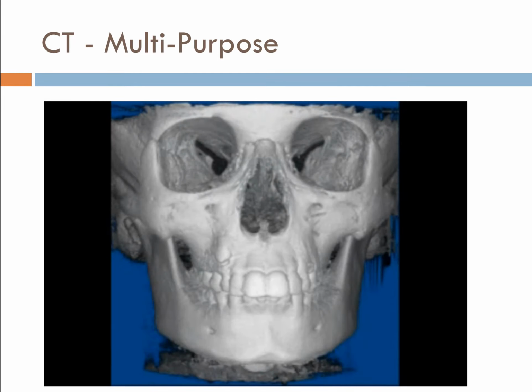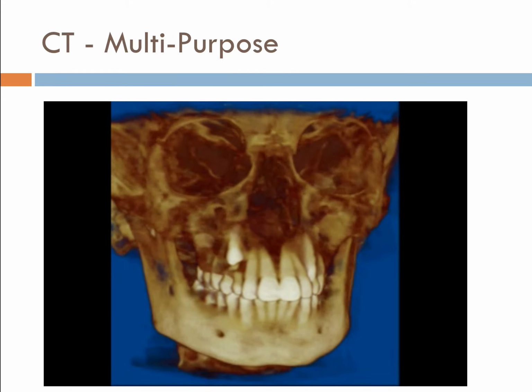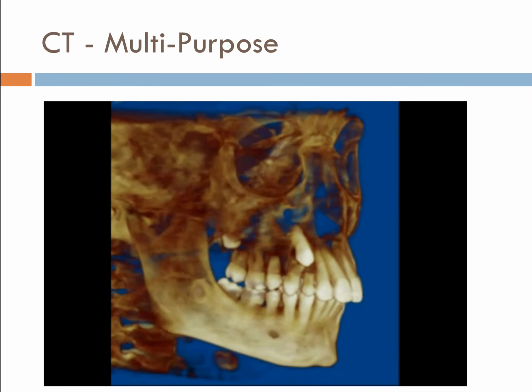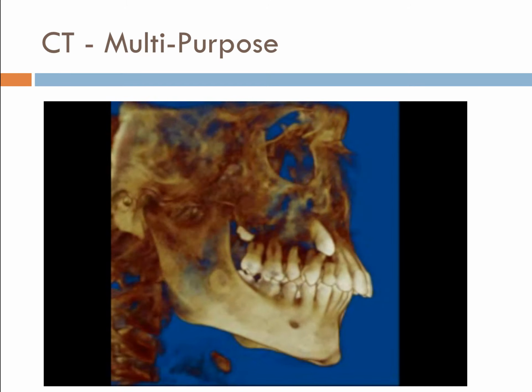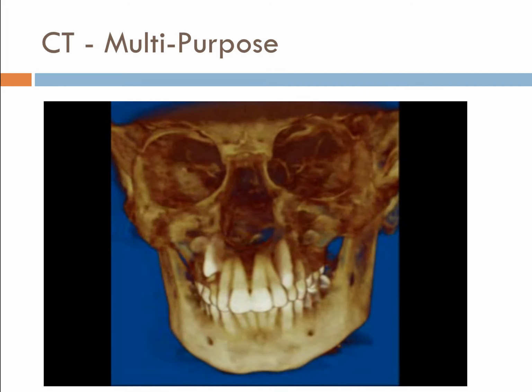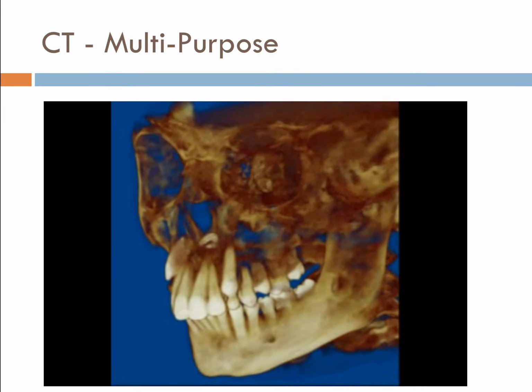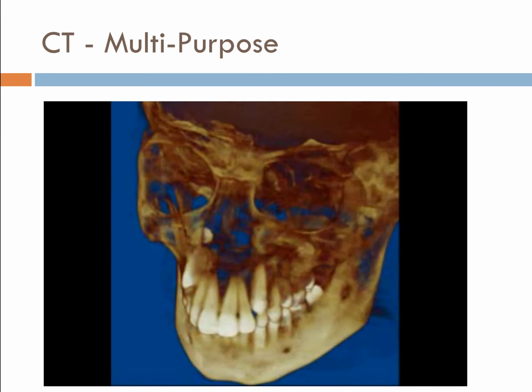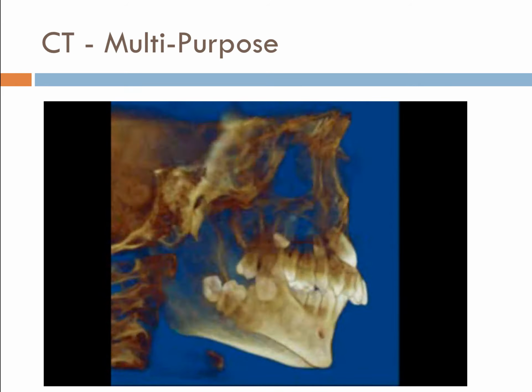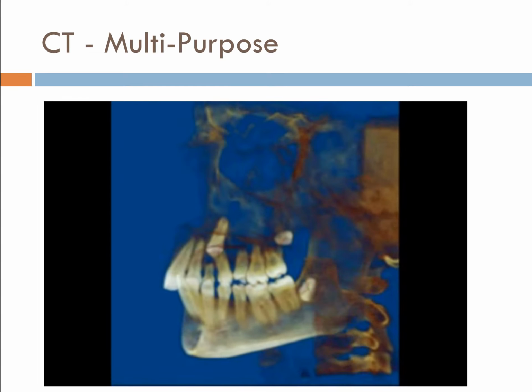Patient's gone through the machine. This acquisition takes around about 20 seconds. Different technology to the $1.5 million one. These machines are a couple of $100,000, and you can see the data, which is recorded in what we call DICOM, or Digital Imaging Communications in Medicine, a specific format for medical images, and it's fed into a software.